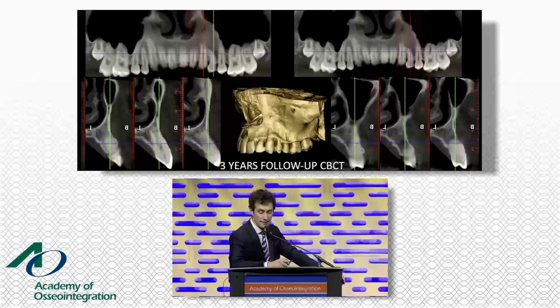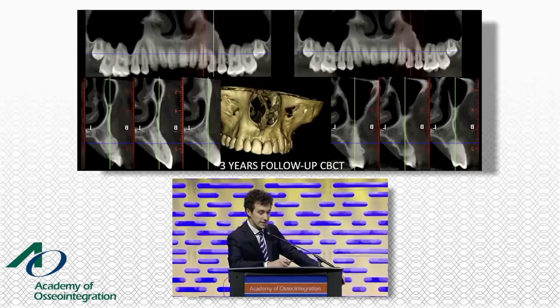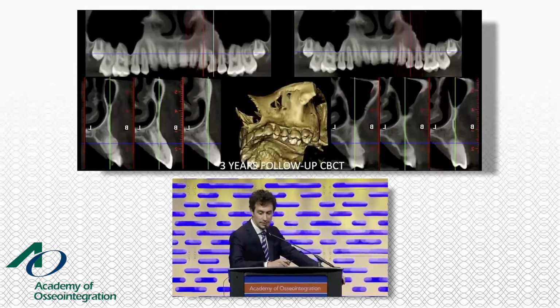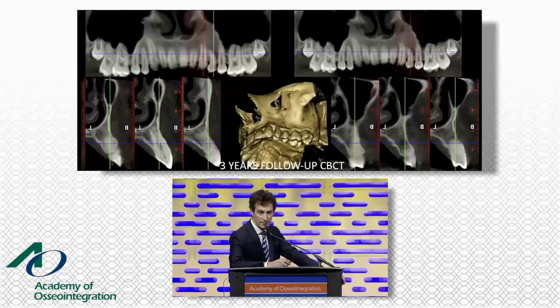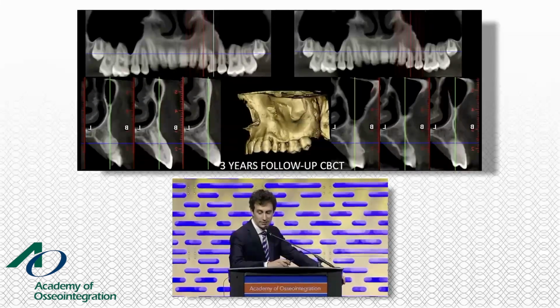This is the three-year follow-up CBCT. As you can see, there is new buccal bone on the vestibular part of our cuspid, and we can see that the graft has been resorbed and substituted with new bone of the patient.